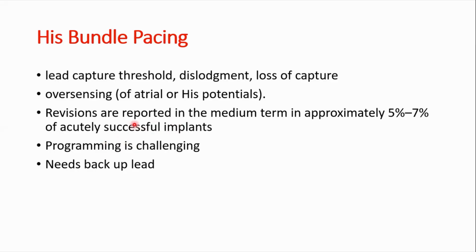Is it challenging in a patient having His bundle pacing, especially if you are going to implant a CRT-D with it? It actually would be very challenging, and really needs a backup lead.